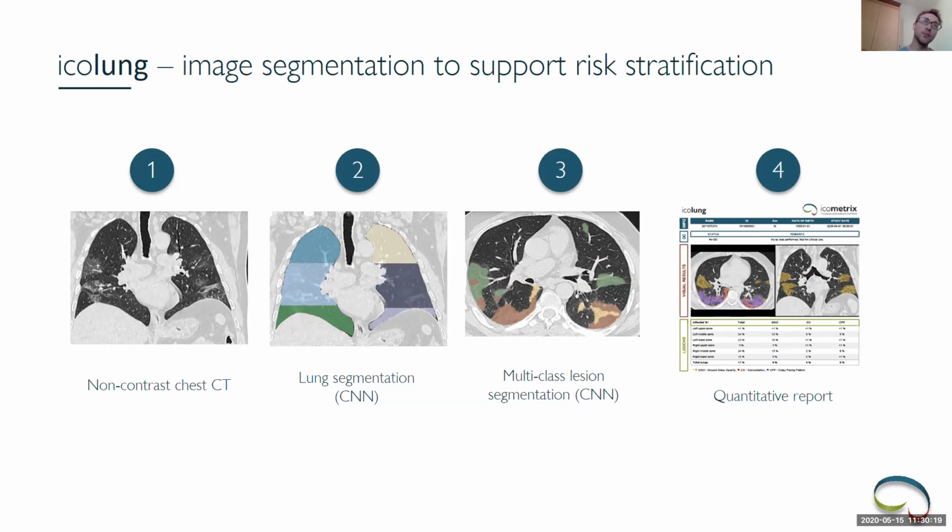And as you remember from my previous slides, this is a technological solution that can help in the risk stratification, which helps the radiologist and the treating physicians.